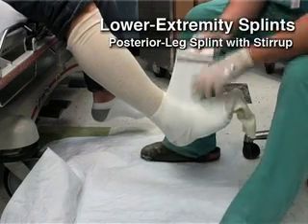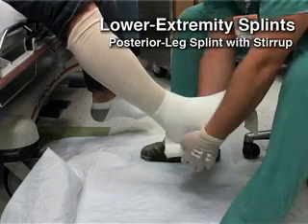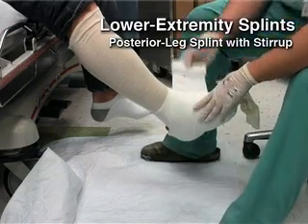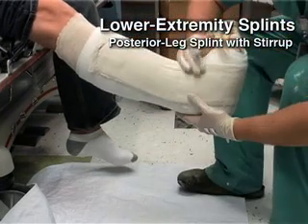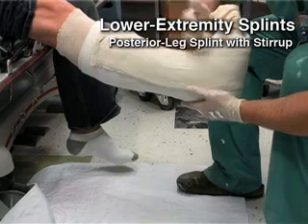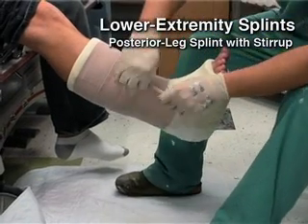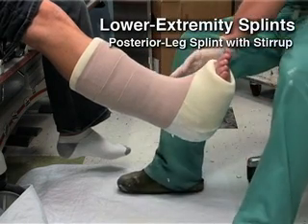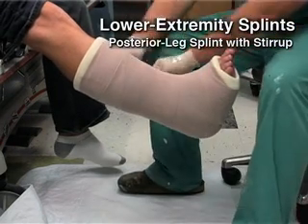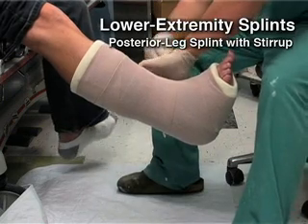Adding a lateral stirrup component to a posterior leg splint increases splint stability and prevents inversion or eversion of the ankle. This splint provides greater immobilization and stability for fractures near the ankle. The stirrup splint is similar to the sugar tong splint for the upper extremity. Apply the splint to the medial and lateral leg extending from the tibial tuberosity to wrap around the foot and end just below the fibular head. Mold the splint with the ankle at a 90-degree angle.